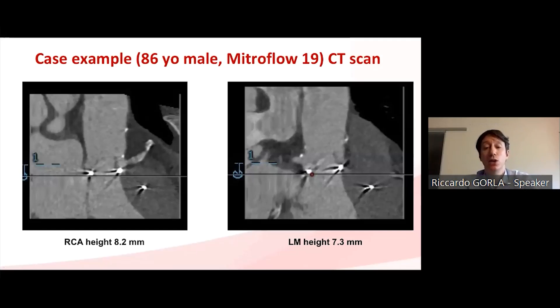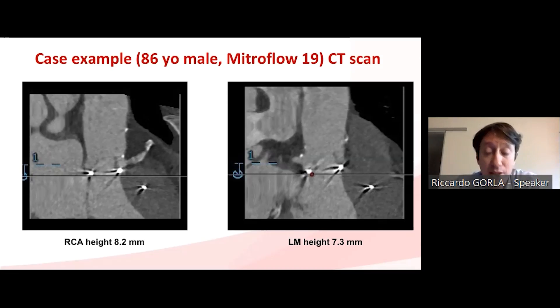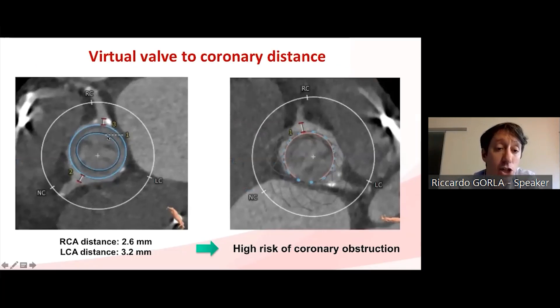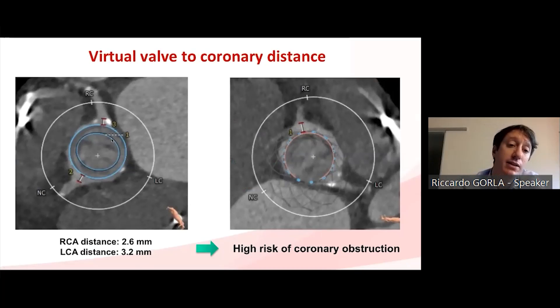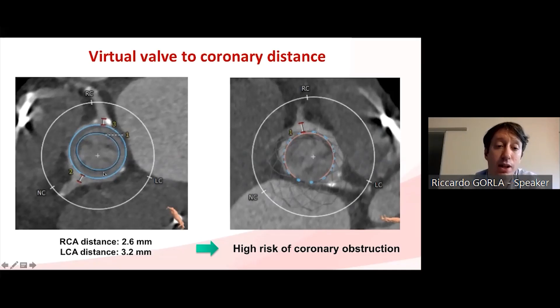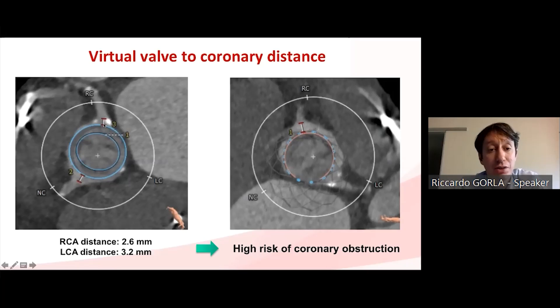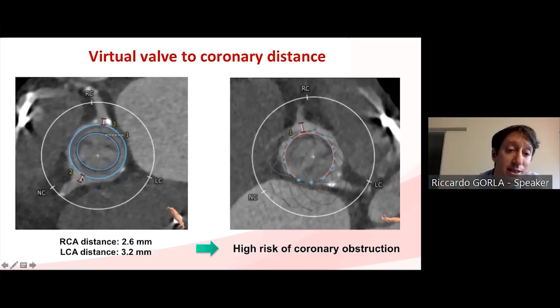Here is a case example summarizing what has been discussed. This is a male patient with a degenerated stenotic Mitraflow 19. On CT scan, both the RCA and left main are very low. We simulate implantation of a Portico 23 — the inner circle represents the perimeter of the Mitraflow 19 and the outer circle the Portico 23 — making sure the two circles share the same center. The distance from the Portico 23 to both coronary ostia is below the four-millimeter cutoff, confirming high risk of coronary occlusion.